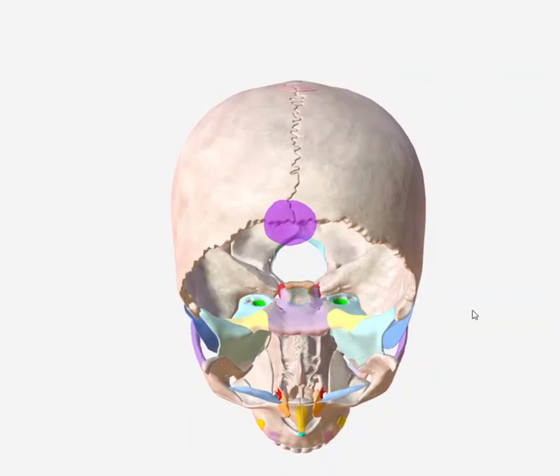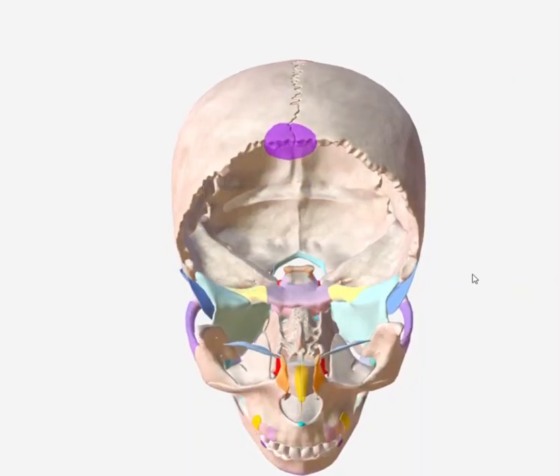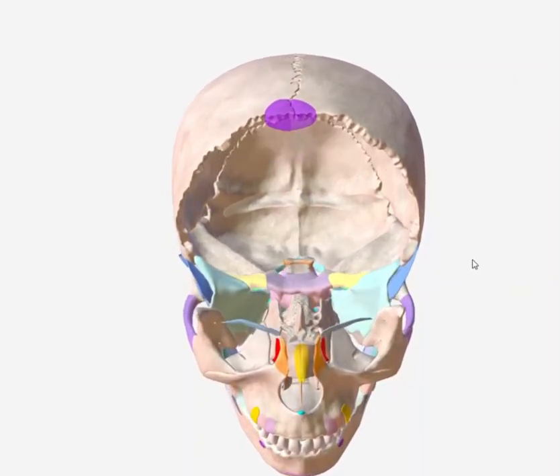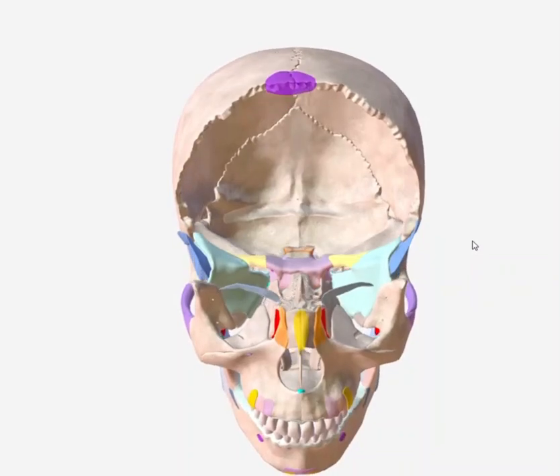Then if I bring the chin up slowly, bring it back to a good position, dorsum sella in the foramen magnum, and then continue up in an upward motion, this is extension. And as you can see, that dorsum sella goes higher and higher than the foramen magnum in the back.